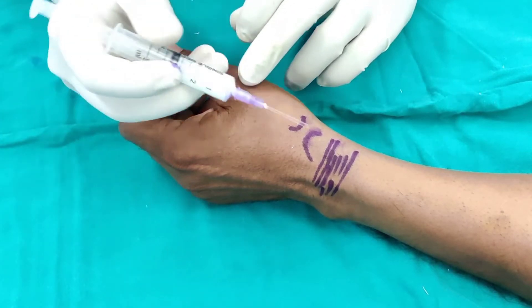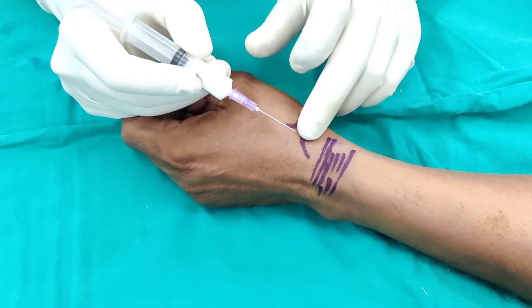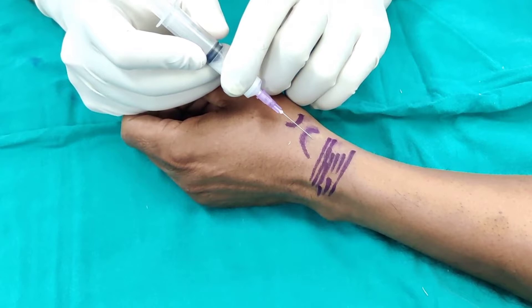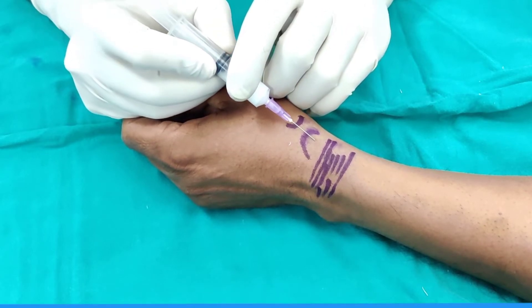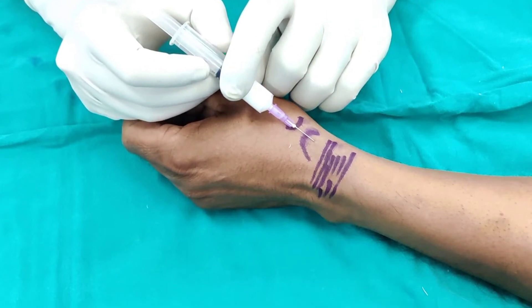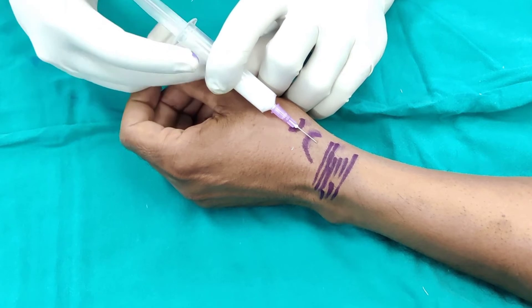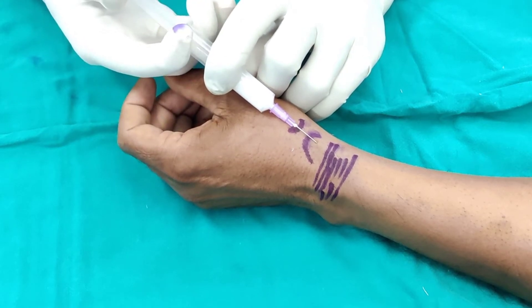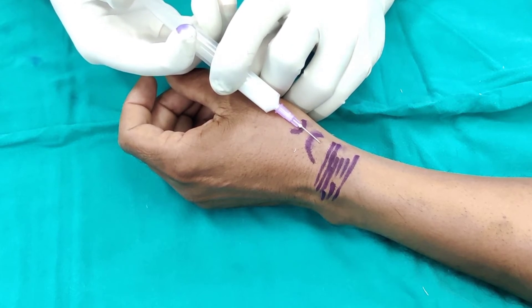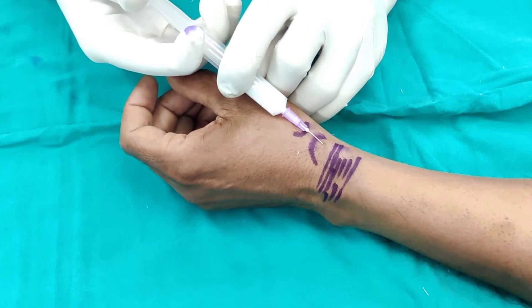Our starting point is just distal to the radial styloid — I've done it slightly distal. Just stay distal and be horizontal. You don't want to be going perpendicularly because then you will be going into the tendon. Always aspirate, and then slowly you can see that it will start to swell up. Just be very gentle.